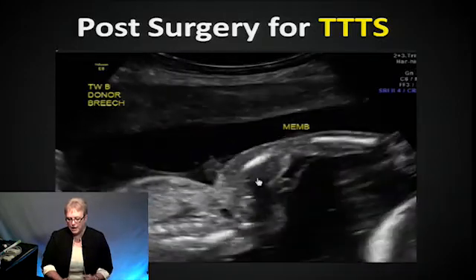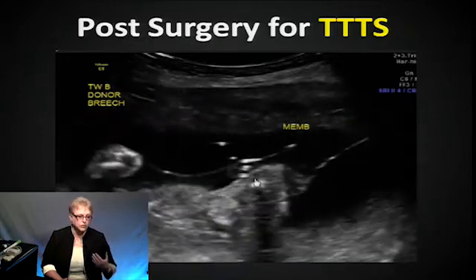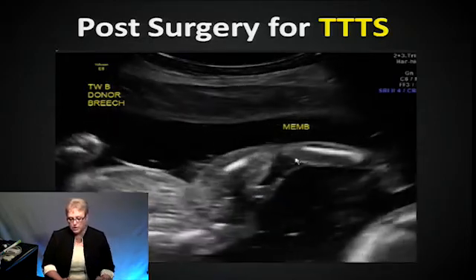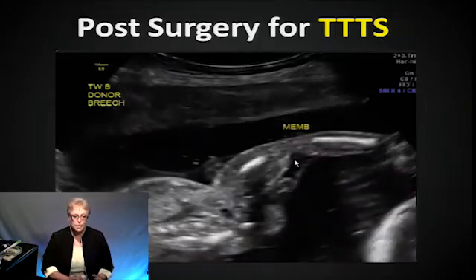But this baby was so happy to be able to move around. You started to see fluid in the stomach, you started to see fluid in the bladder, and then nice fluid coming around the baby, giving that baby some room. And then the Dopplers went back to normal.